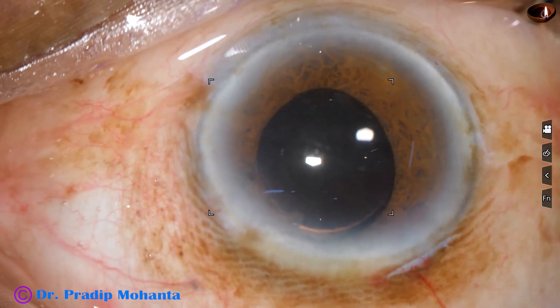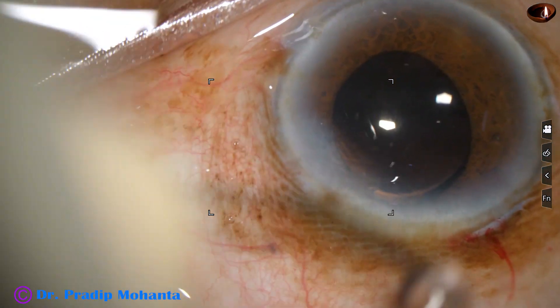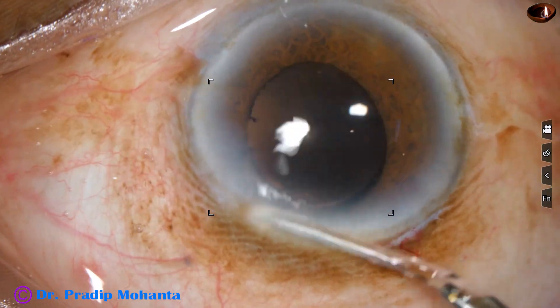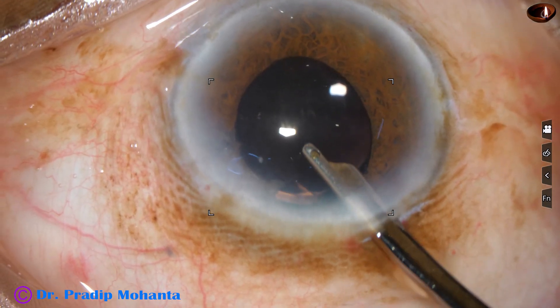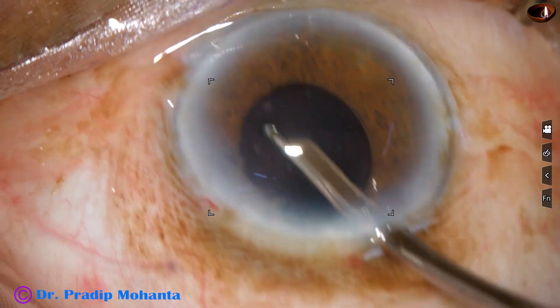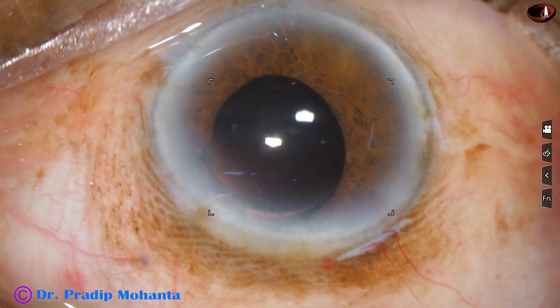This is moxifloxacin. Look at the main wound — there is no sign of wound burn. This is probably the beauty of the Oatly tip design. The tip is wider at the mouth and its shaft is narrower, so there is a lot of water flow around the metal needle, keeping the wound always cool. The anterior chamber is nicely formed and the case is concluded.